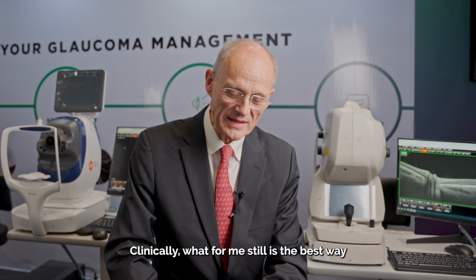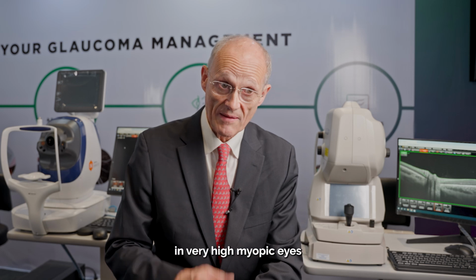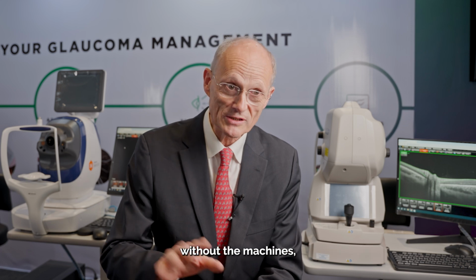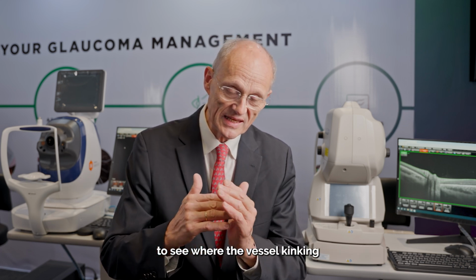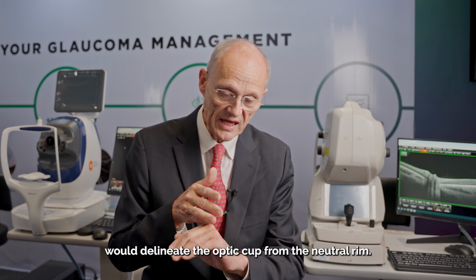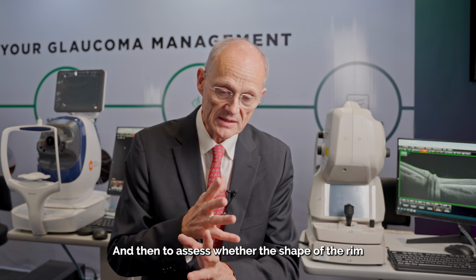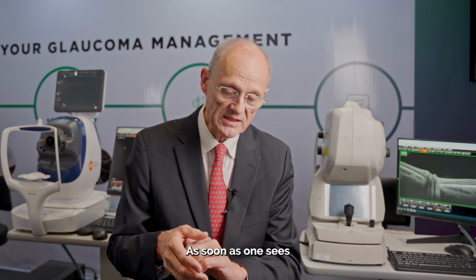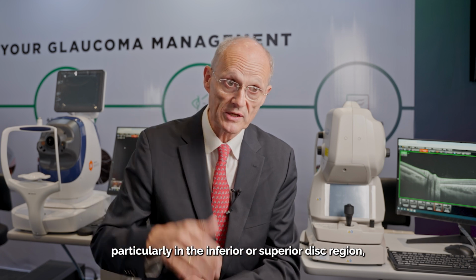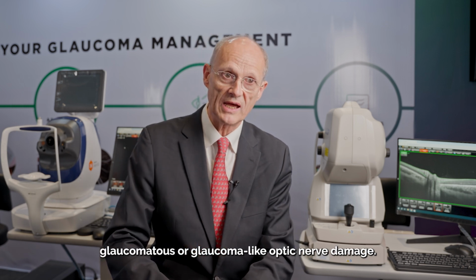Clinically, what for me still is the best way to decide whether there may be glaucoma or glaucoma-like optic neuropathy or not in very high myopic eyes is still the ophthalmoscopic look onto the optic disc, without the machines, to see where the vessel kinking is in the optic disc. And a slight but definitive vessel kinking would delineate the optic cup from the neuronal rim, and then to assess whether the shape of the rim still appears to be normal or not. As soon as one sees that the vessel kinking is close to the optic disc, particularly in the inferior or superior disc region, that would markedly raise the suspicion for glaucomatous or glaucoma-like optic nerve damage.